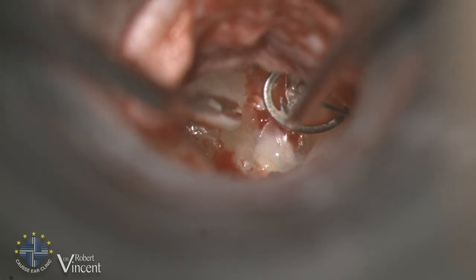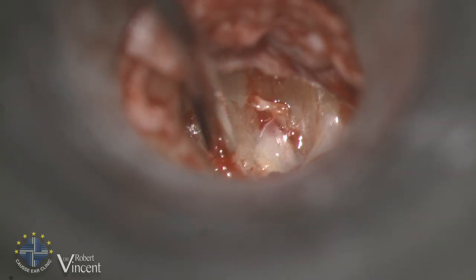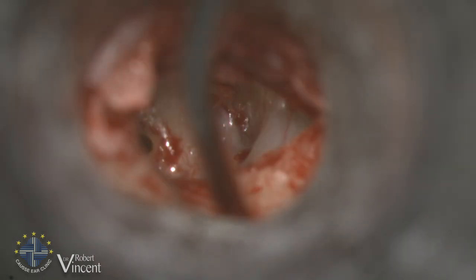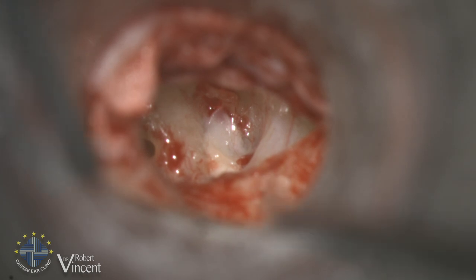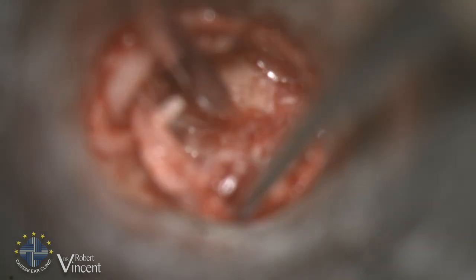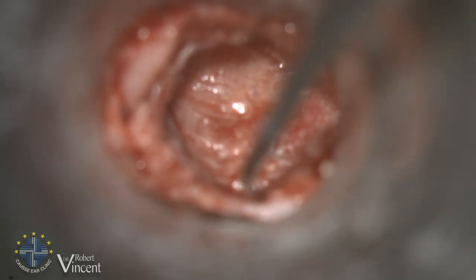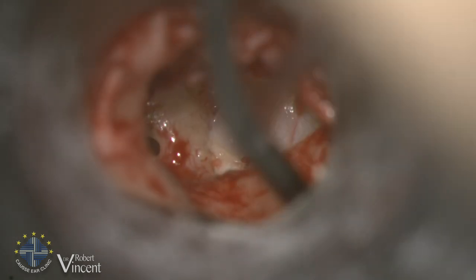It's completely dislocated — nothing is connected to the tympanic membrane, so it doesn't work well. The point of this malleus prosthesis is to recreate the malleus handle, recreating a point of stability at the level of the tympanic membrane. Especially in this case when you don't have any more residual ossicles, it's very difficult to have stability. You can see this really lateralized tympanic membrane.